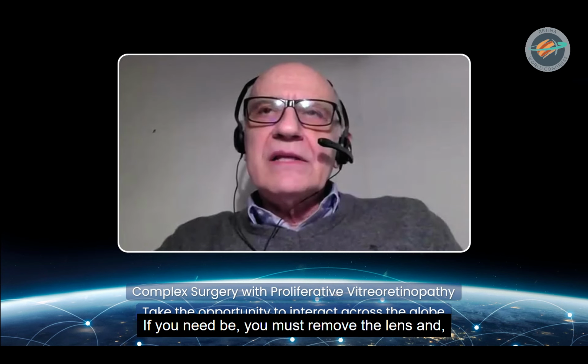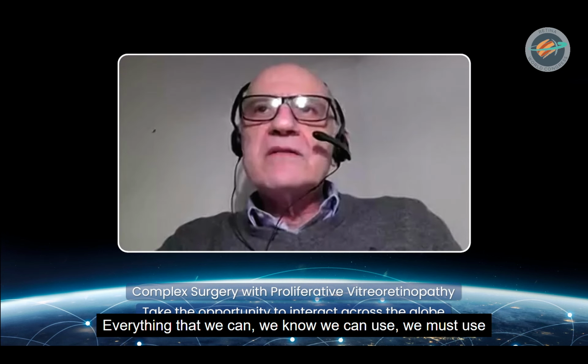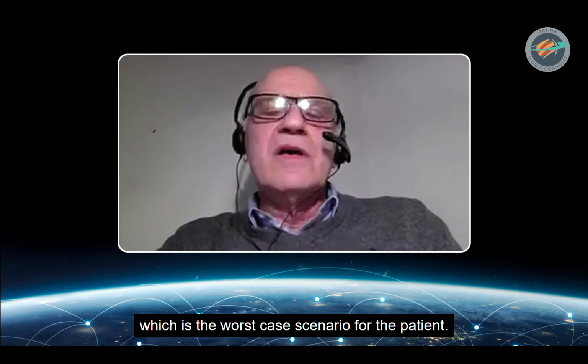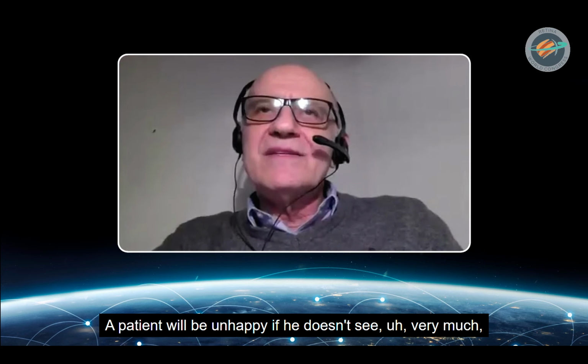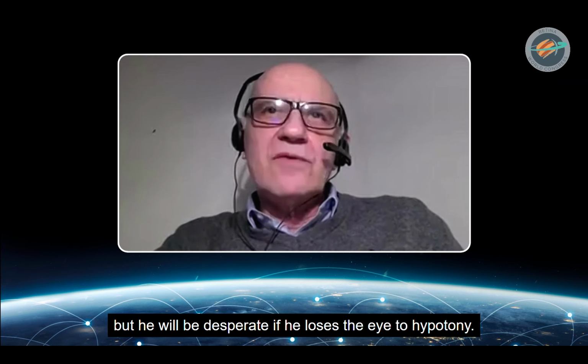If need be, you must remove the lens and address the ciliary body with indentation, with chandelier, by manual techniques. Everything that we know we can use, we must use to deal with the ciliary body, so that we do not end up with hypotony, which is the worst case scenario for the patient. The patient will be unhappy if he doesn't see very much, but he will be desperate if he loses the eye to hypotony. So we must focus on that.